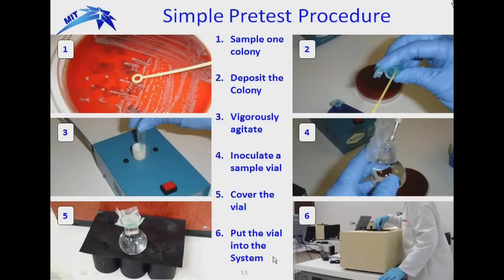Our sample preparation procedure makes sample vials with only a few thousand bacterial cells per cubic centimeter. And at this concentration, a cell will pass through the laser beam once every few seconds on average. The actual rate depends on the concentration. The sample is in position and ready for an identification test.